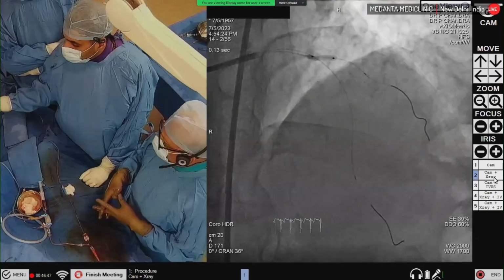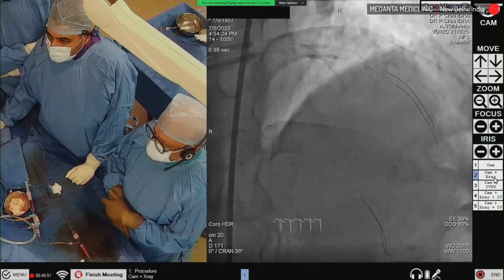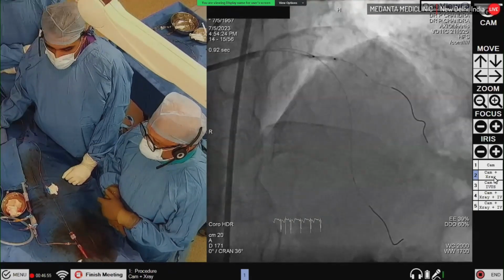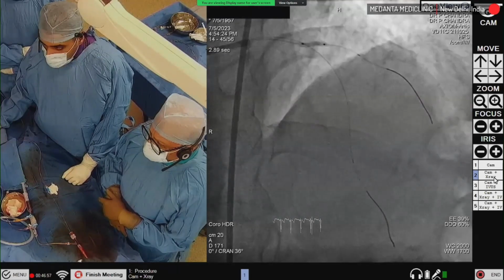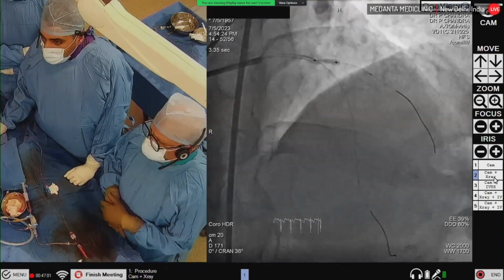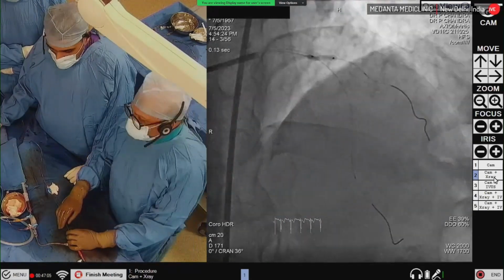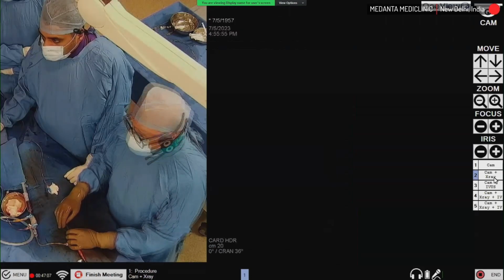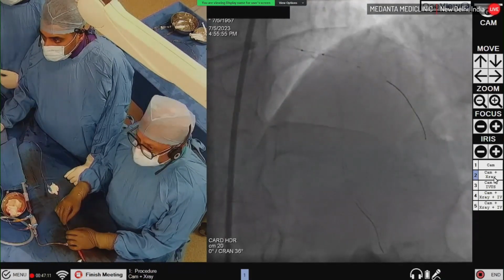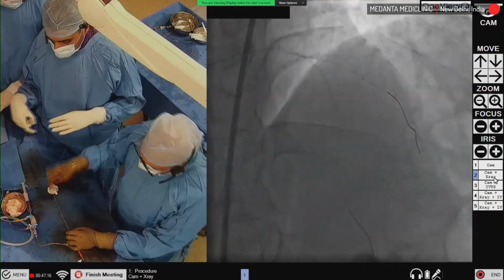Okay, 3 into, no, 3.5, 15 is okay. It is 1 minute 23 seconds, and we will stop at 1:30 because he's having some chest pain. So we'll stop at 1:30. Okay, deflate, please. So it's 1 minute 34 seconds, and I'm taking this out.